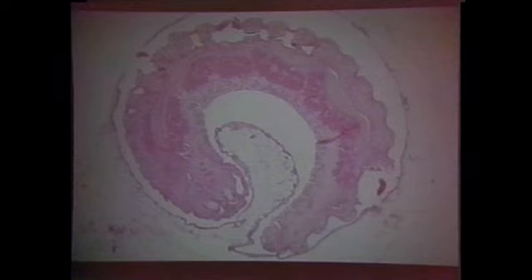Another phylum of worms are Pentastomes. These were once thought to be mites because their first larval stage is identical to a first larval stage of a mite, but we now know that it is another phylum to itself. Pentastomes have hooks on the anterior end. They have intestines, and they have eosinophilic glands, which follow the intestines probably for the first half of it. Now, here are the eosinophilic glands. I just point these out because no other animal has these things. They're called pentastomes because they usually have 2 pair of hooks and a mouth. Pentastomid means 5 mouths. They thought that these were kind of mouths as well. Now we know they're hooks. And you can pick up these hooks in section as well.